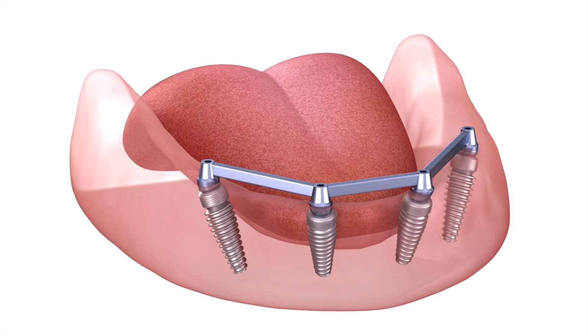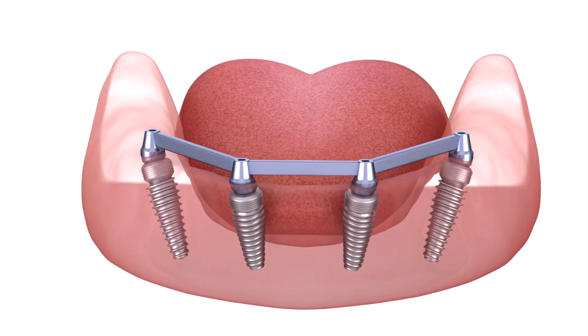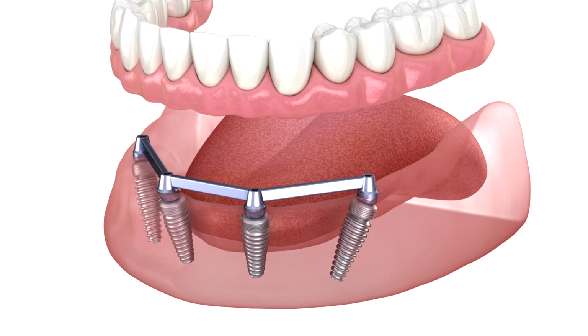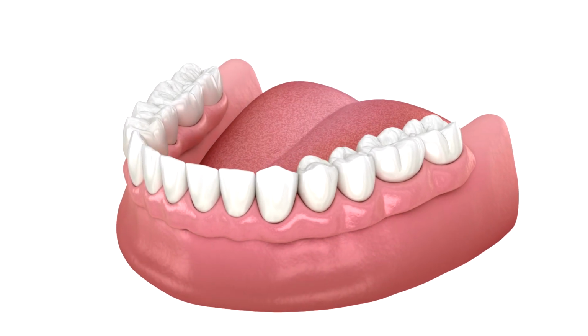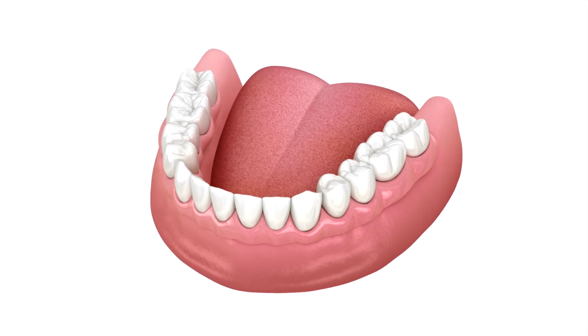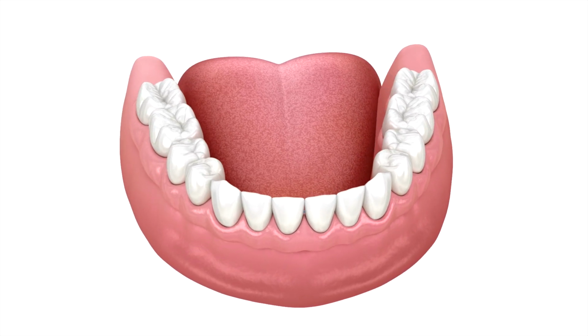First, the dentist prepares the jawbone. Then, the titanium implant post is surgically placed. After healing, an abutment connects the implant to the crown. This is what is a dental implant at its core, a complete tooth replacement system.